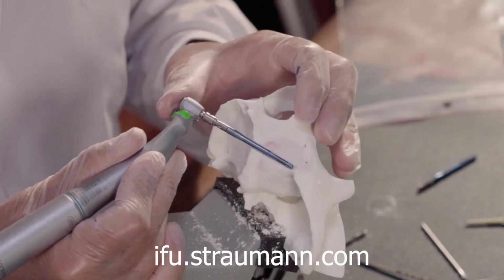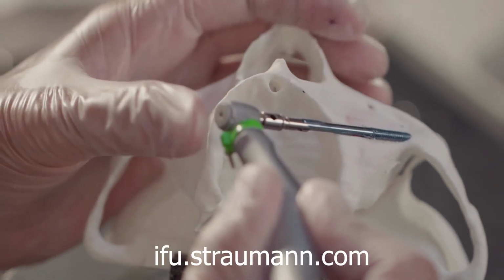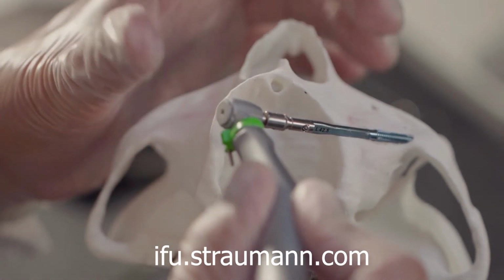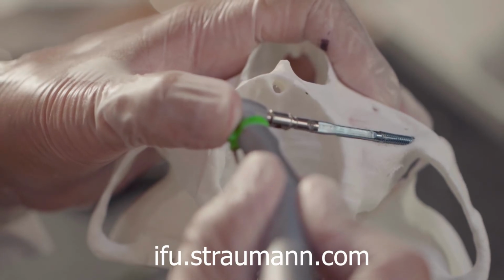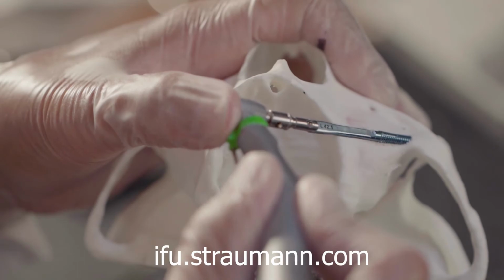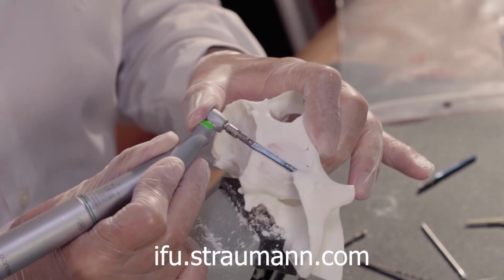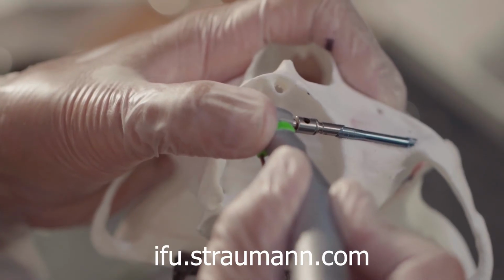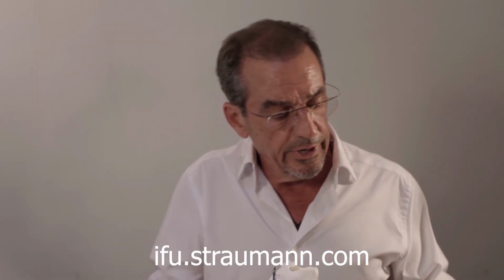We already have the implant mount in place. So now we are smoothly placing the implant. Again, the thumb of the left hand is pressing, the right hand is maintaining the implant direction. You maybe can observe the micro threads around the implant neck. Okay, let's stop it. So we'll finish by hand.